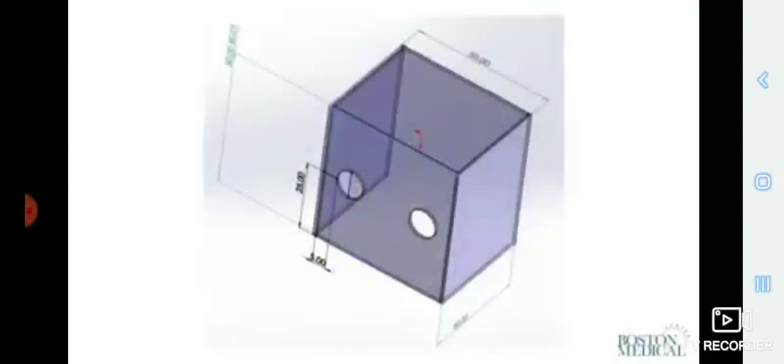As we grapple with supply problems, a Taiwanese anesthesiologist recently shared the design of a reusable protective device to reduce droplet and aerosol exposure during airway management. This aerosol box is a plastic transparent cube designed to cover a patient's head with two orifices to insert the hands while performing a procedure.